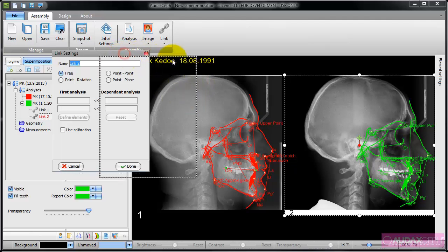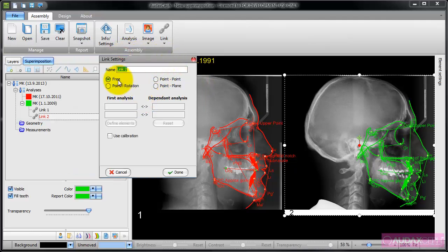Links could be free, could be point to rotation, point to point, or point and plane.